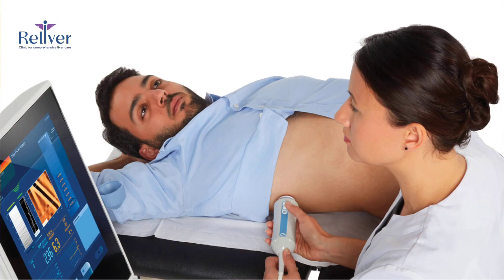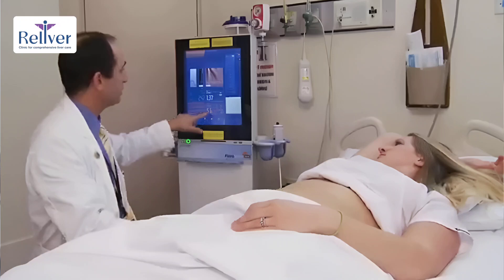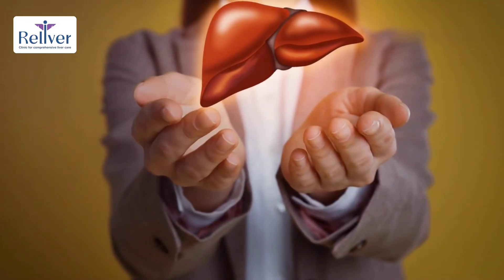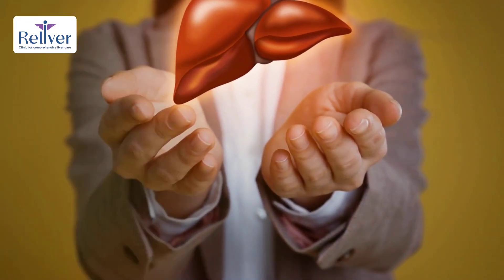The test is performed at regular intervals to monitor disease progression, offering benefits such as rapidity, reproducibility, reliability, and safety since it's non-invasive. FibroScan is more than a test — it's a step toward better liver health.